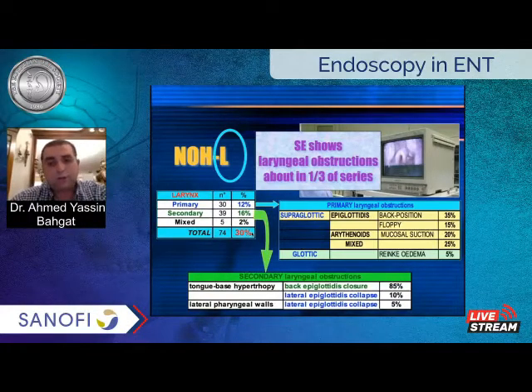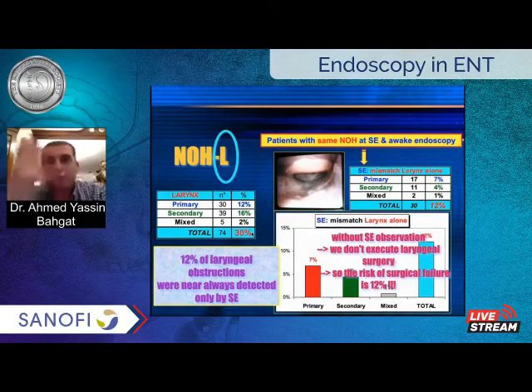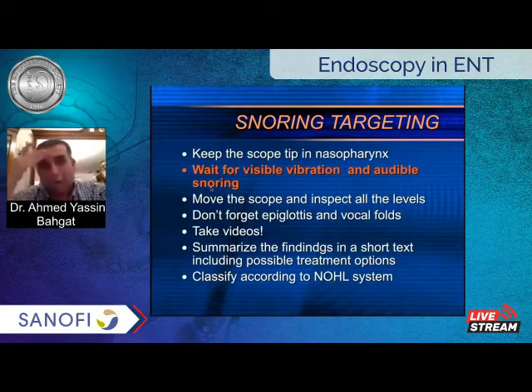So it's very important because it's not the same as an awake endoscopy, and you are missing one third of your cases. In snoring, the aim of sleep endoscopy is just looking for vibration. Go into the airway and look at the vibration with the audible snoring, and then try to fix it. But in sleep apnea, we are not looking for snoring, we are looking for airway obstruction and collapse.